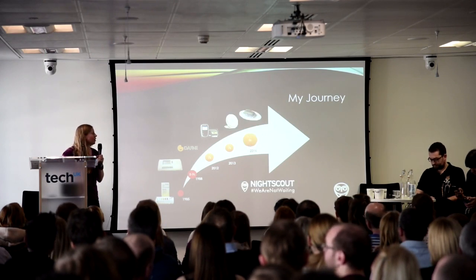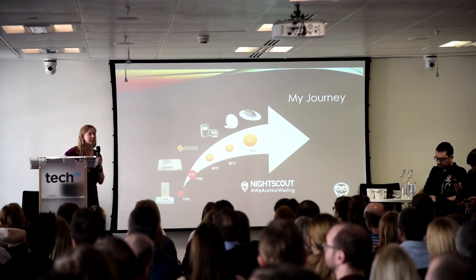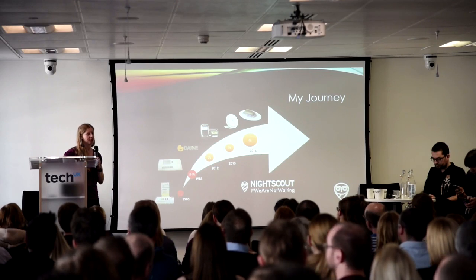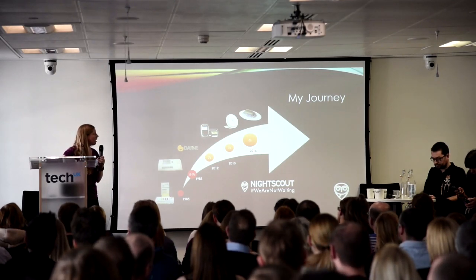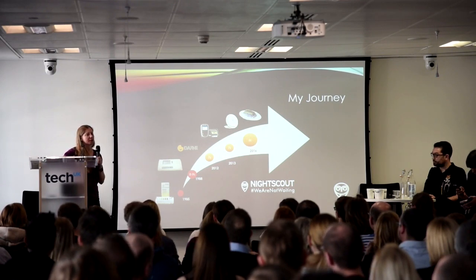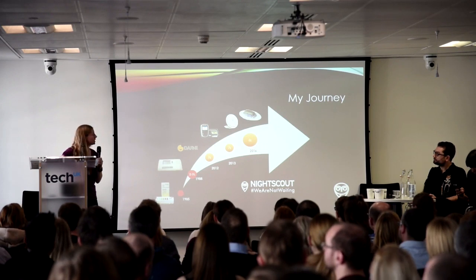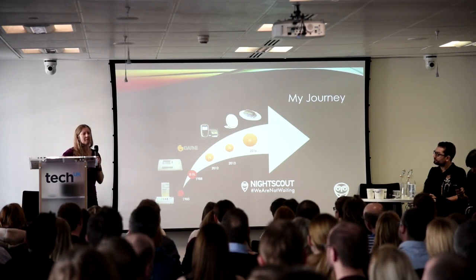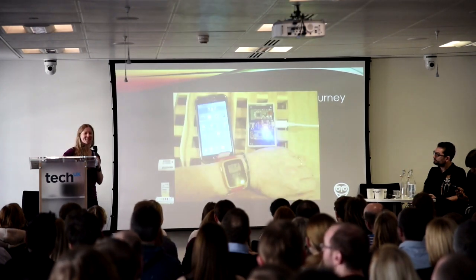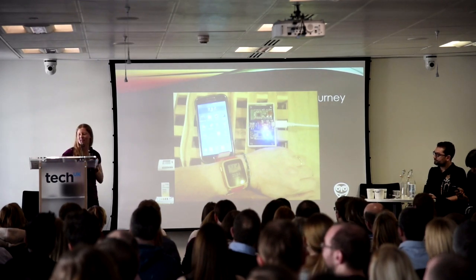I nervously started using CGM. I was really scared of the cost of it, and I was very grateful to my parents who offered to fund it, and they still do, and I couldn't do it without them. I started off with the Libre and then moved quickly onto Dexcom because I wanted my data in real time. I started using Libre in January. By February, I found Nightscout on Facebook, and I got data on my watch. Only about 10 years later than my mum said, but I got data on my watch.